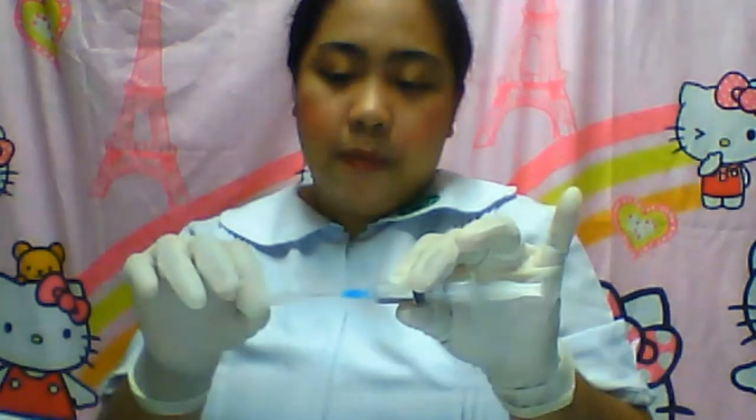All right, we're done. There are actually two ways of recapping to maintain the sterility of the medication. The safest is the fishing technique — I'll show you how to fish.